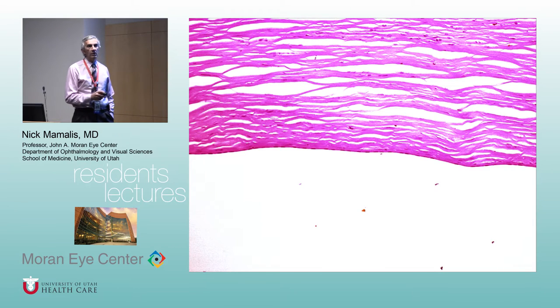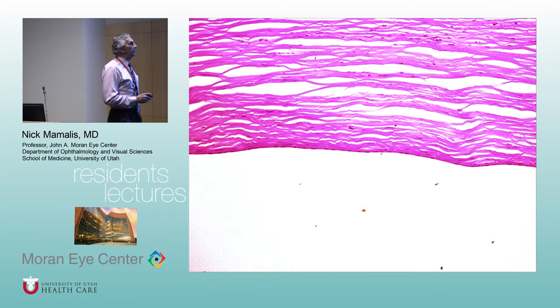All right, what layer are we looking at right here, Reese? Endothelium and Descemet's. Okay. Tell me about PAS staining and Descemet's. It will stain. So Descemet's is indeed a basement membrane. In fact, if you were to look at Descemet's with electron microscopy, it is really two layers. There's an anterior banded layer, and that's thought to be the congenital one. Banded meaning bands of collagen. You have to do EM to see them, and they're very regular, and that's almost the congenital Descemet's membrane.